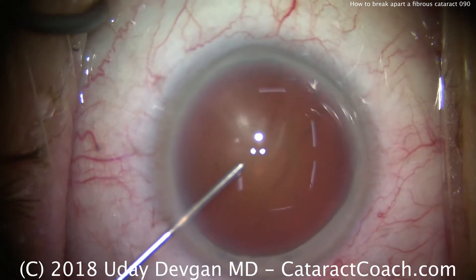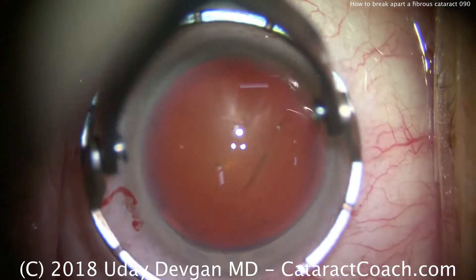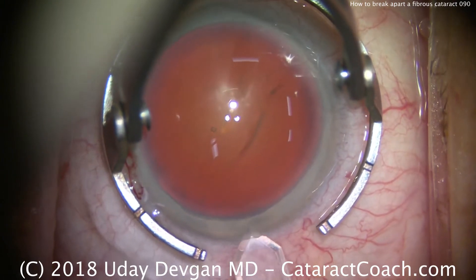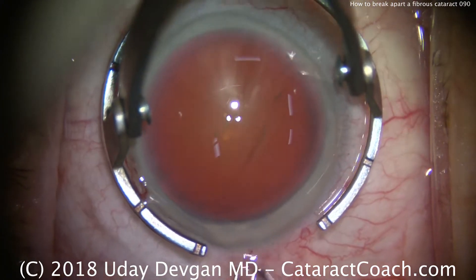Notice how we do an exchange. Now we're going to make our main incision here, fixating the eye with the ring. We're going to use our diamond keratome to make a temporal phaco incision. Appropriate tunnel length.